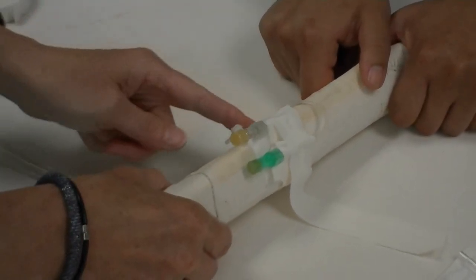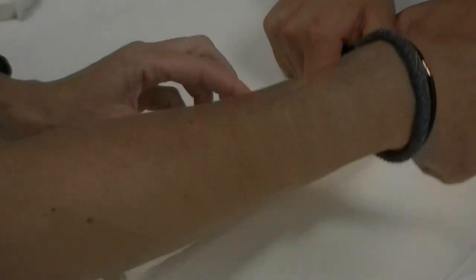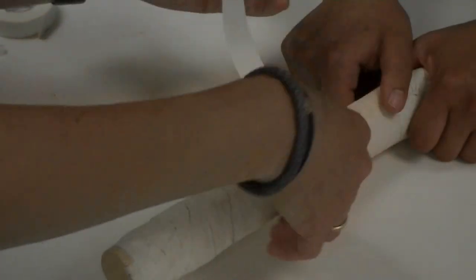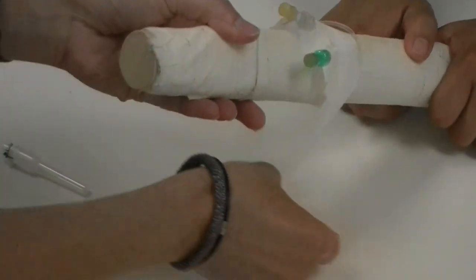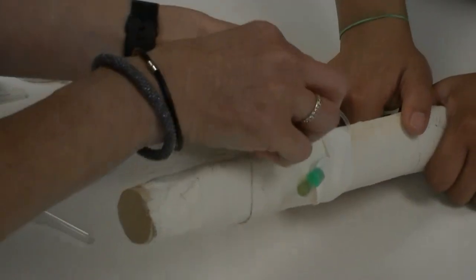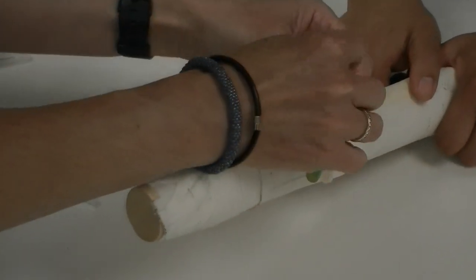I'll come back around the patient and attach it this way. If this connection creates a kink anywhere, then I could also go below this loop and then back around again, making sure I tab my tape for easy removal.